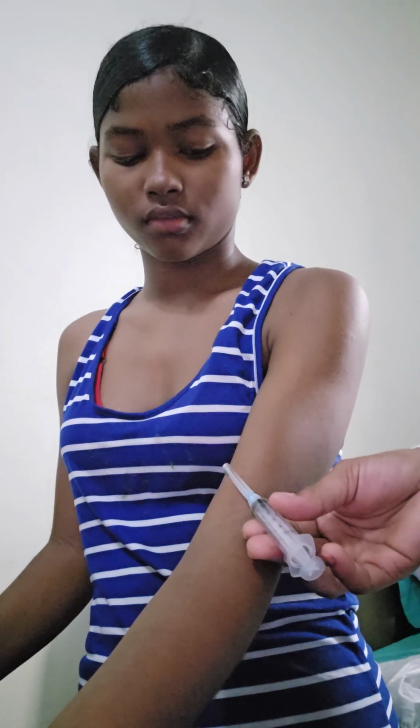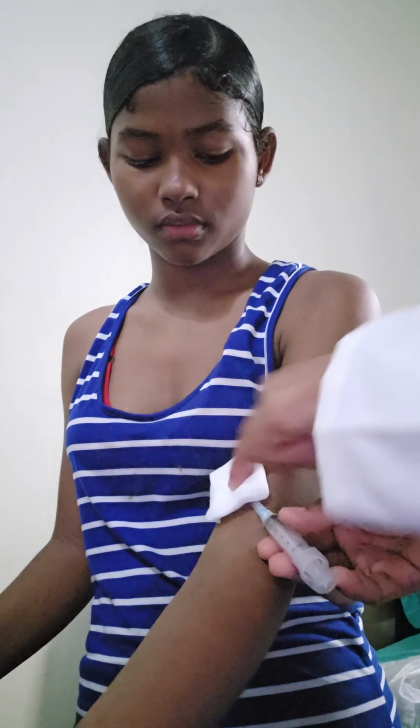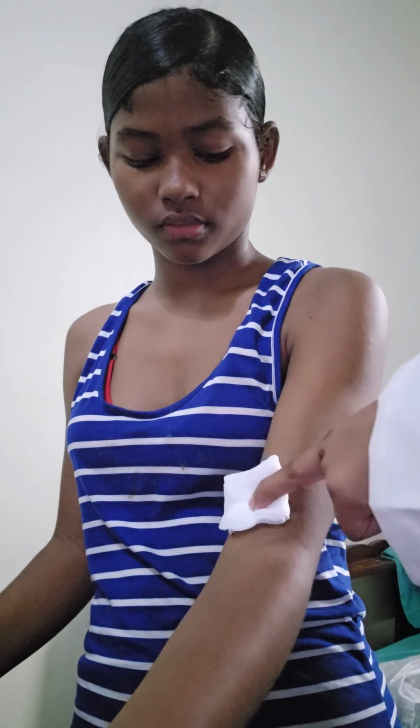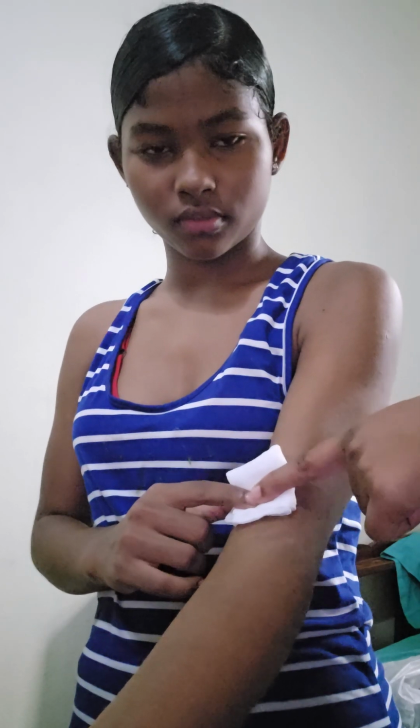The technique of removing the needle: you apply the gauze, then you withdraw the needle. You apply pressure, and then you label the specimen.